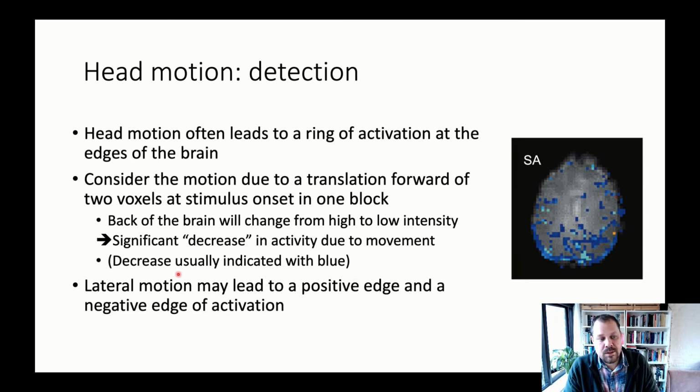And obviously, if we do lateral motion, so from left to right, then you get positive activation on one side and negative activation on the other side, right? Depending on which way the movement is.